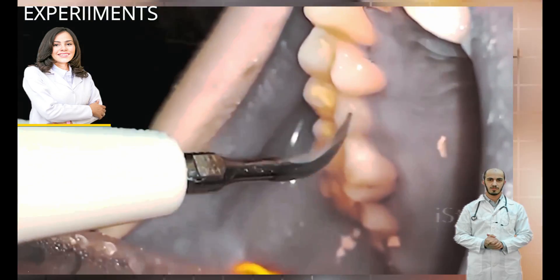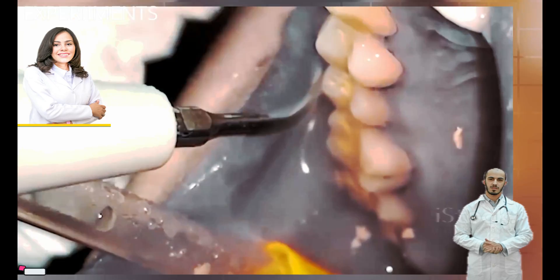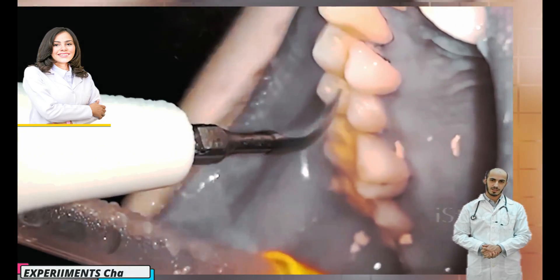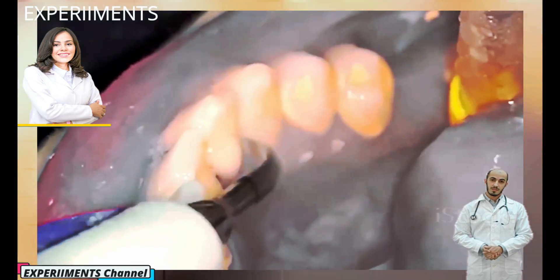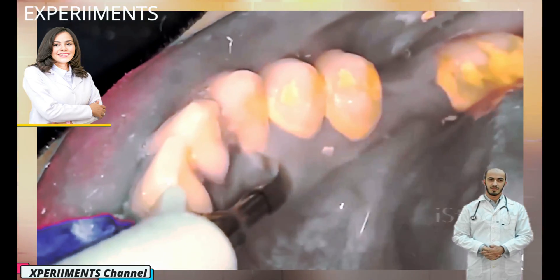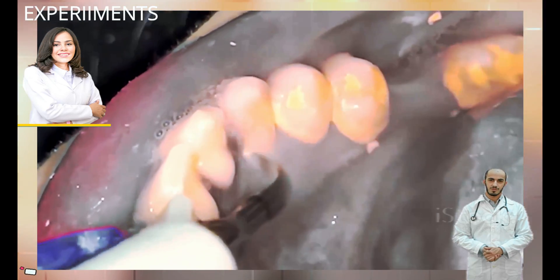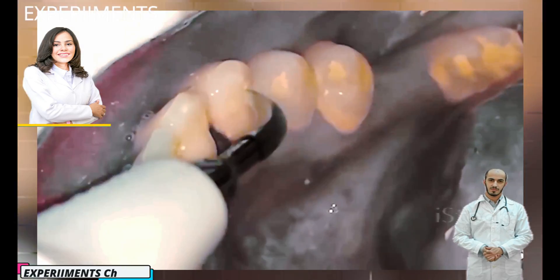Or what is now called calculus, which is this hardened form of plaque that you see. The bacteria that's associated with this plaque and tartar is what eats away the supporting structure around your teeth. So once it forms to this, you cannot brush it or floss it away.